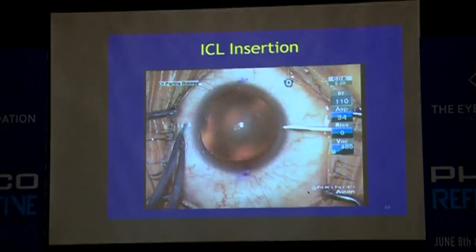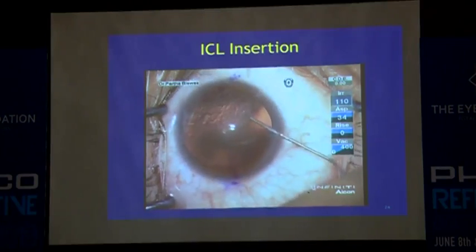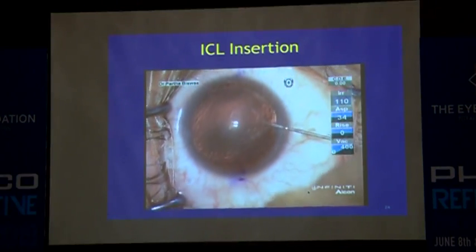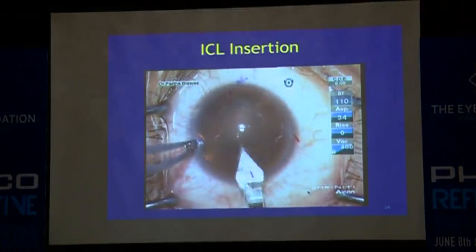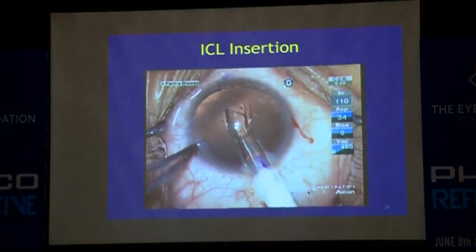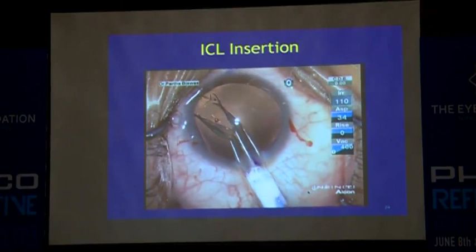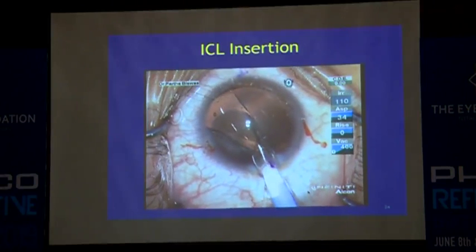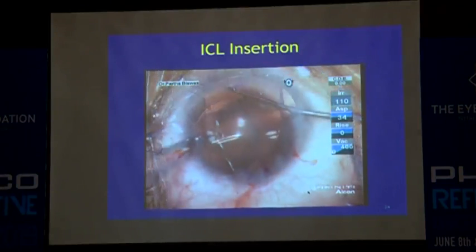So during the insertion, what happens? What we need to do is to place viscoelastic inside the anterior chamber, and the amount of viscoelastic that has to be placed is very important. It should not be an overfill, it should not be an underfill. So when the strands of the viscoelastic methyl cellulose become one with each other, that is the point where you should stop, and that is optimum. And then the ICL is placed inside the eye, inside the anterior chamber, never directly into the sulcus, and it should land actually on the iris surface. So when it is landing a little lopsided, it just has to be twirled around so that it's the right side up, and that is very, very important.